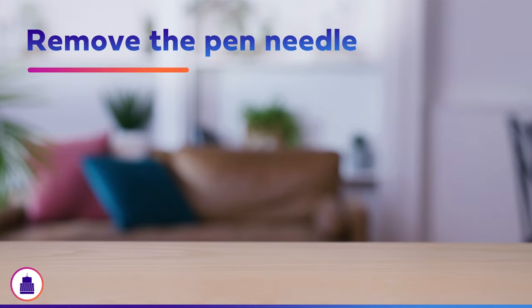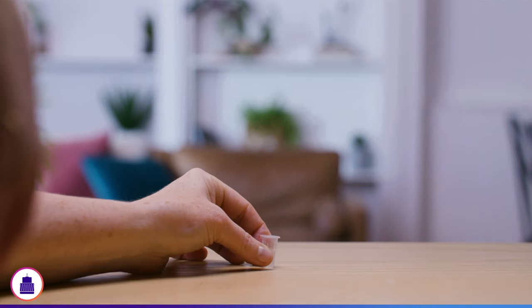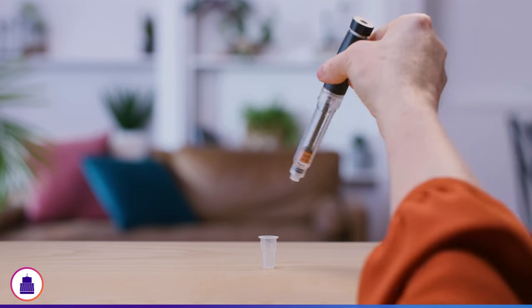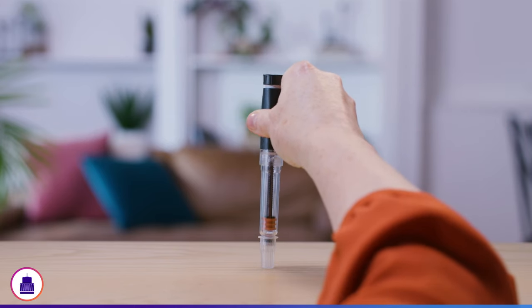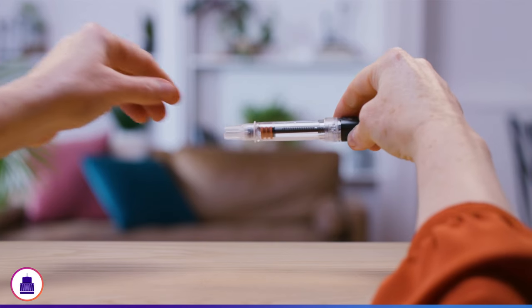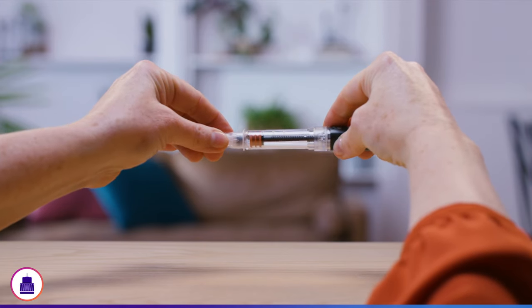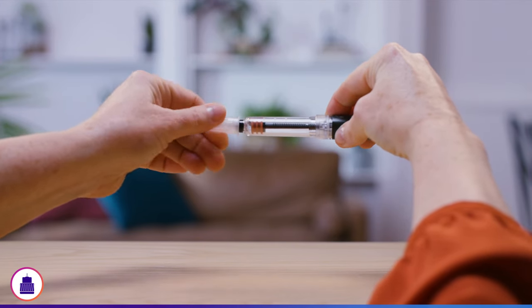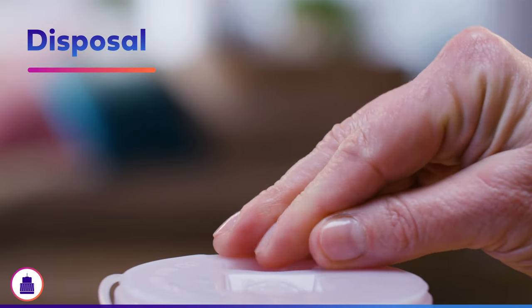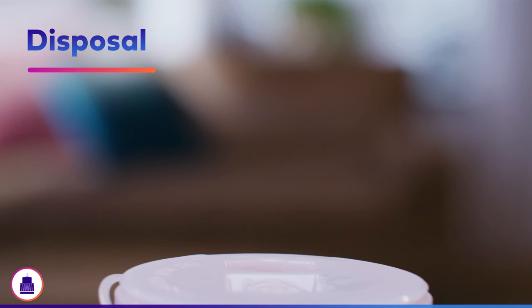To recap the needle, place the outer cover on a flat surface. Then, using one hand, gently push the pen needle directly down into the outer cover. Unscrew the pen needle from the pen. Safely dispose of the pen needle immediately in an appropriate sharps container based on local regulations.